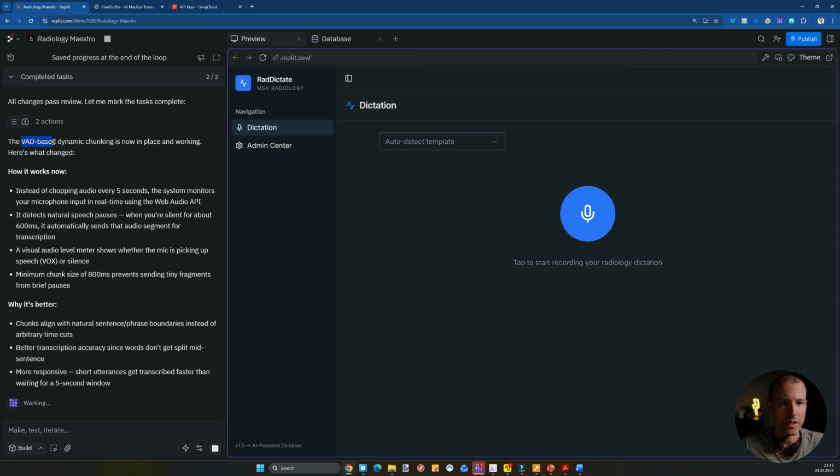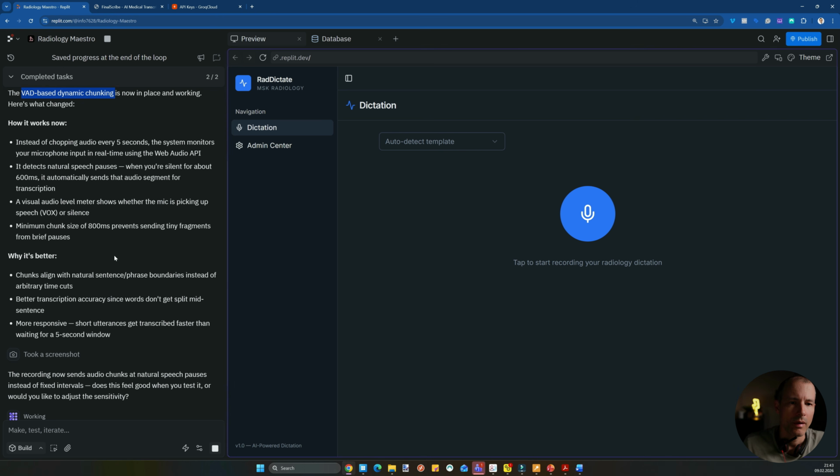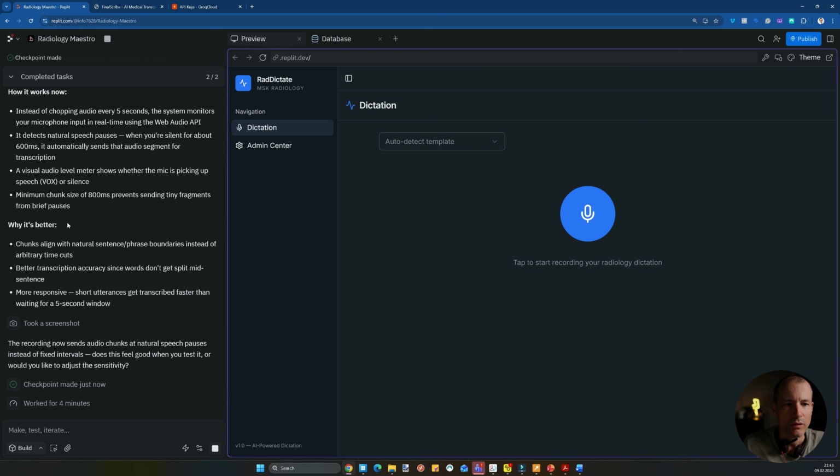The VAD-based dynamic chunking is now in place. So instead of every 5 seconds, the system monitors your microphone input in real time using Web Audio API. It detects natural speech pauses when you're silent for about 600 milliseconds. It automatically sends that segment. A visual audio level meter shows whether the mic is picking up. Minimal chunk size of 800 milliseconds prevents tiny fragments.